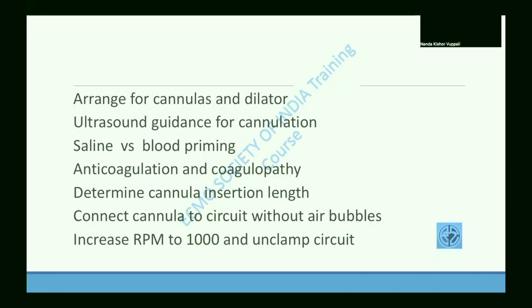And then once you put in the cannulas, connect them to the circuit without air entering it. One needs real hands-on experience for that, how to do it, which you're going to learn in hands-on sessions over the weekend.